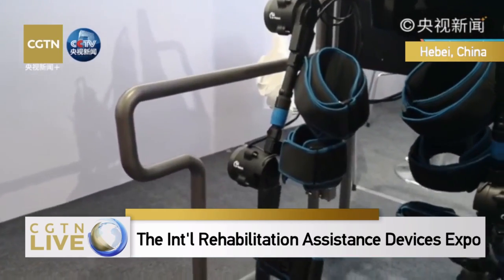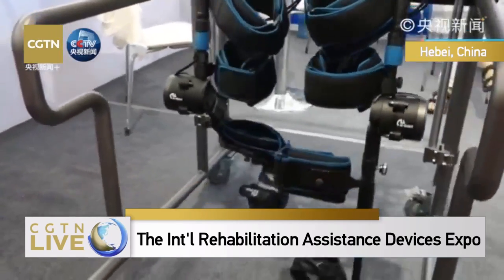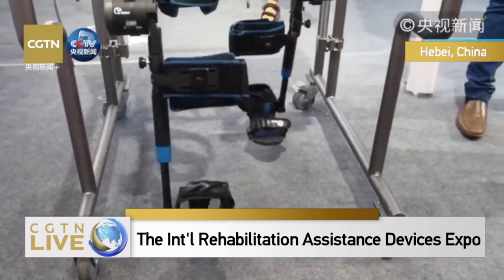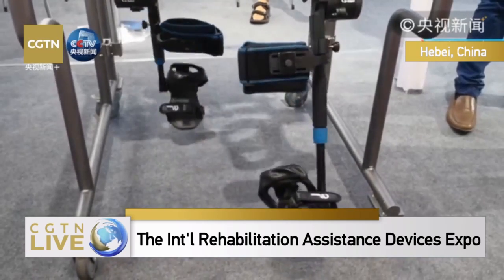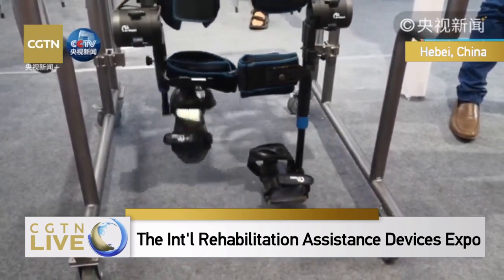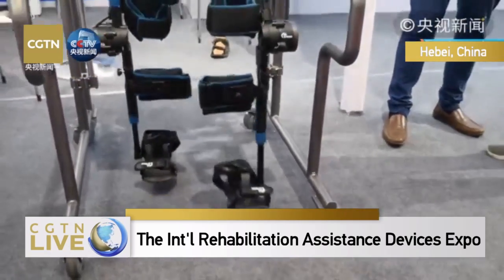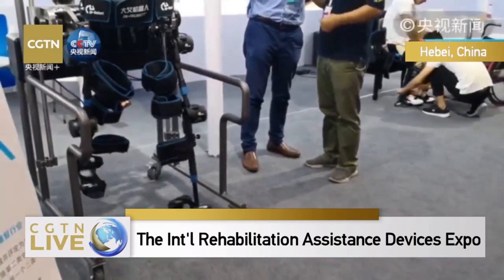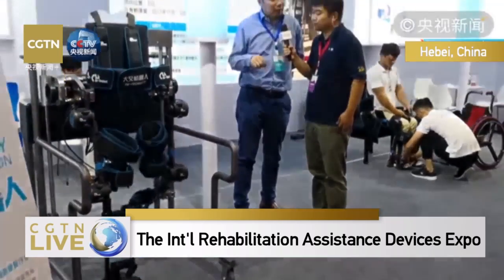Can you adjust the power of the devices? Yes. And it is run by batteries. It has different motors, different sensors, and protection devices, which can adjust according to the parameters of the user.